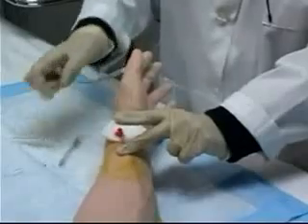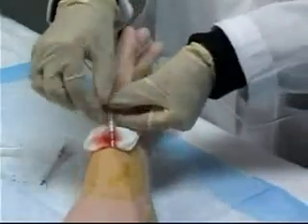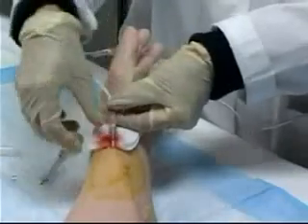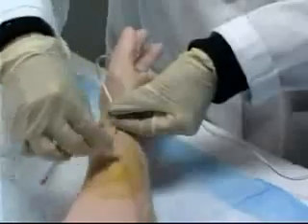Disconnect that and connect my tubing to my catheter and lock it in place. Dry the area.